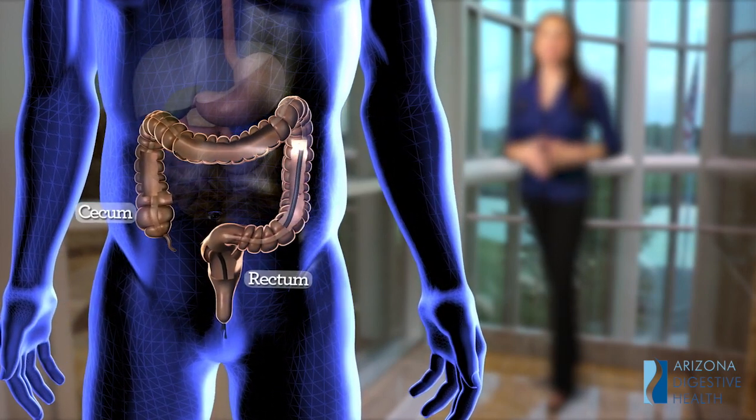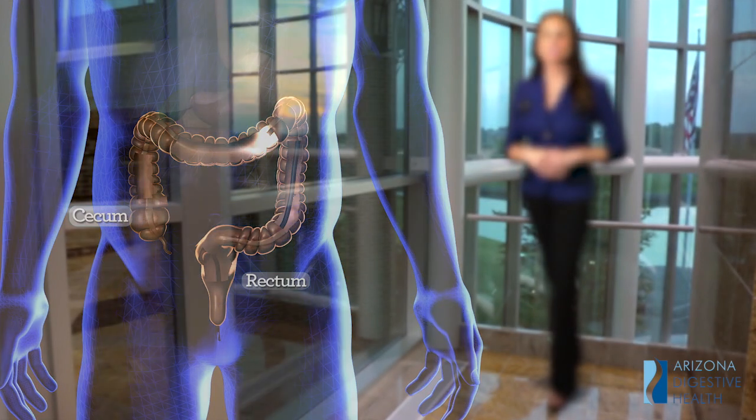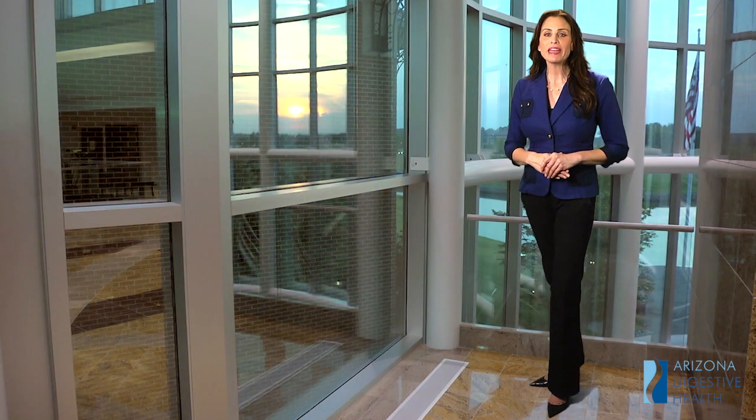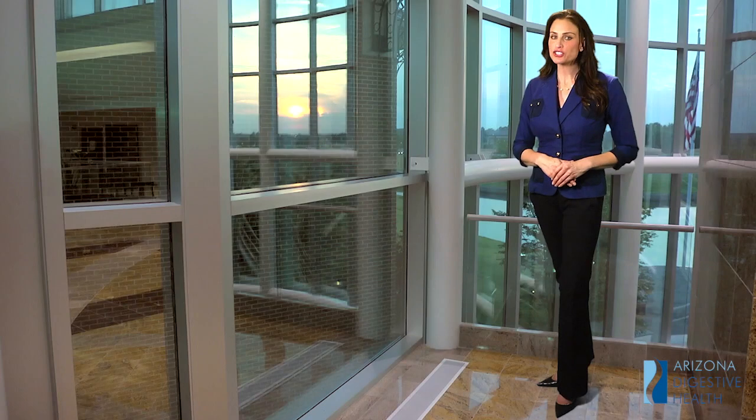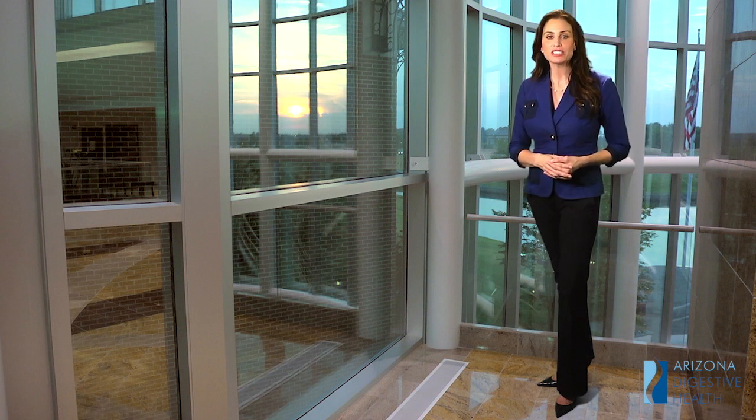With precise movements, your doctor will guide the scope into your rectum around the curves of your bowel to the lower left end of the colon, examining the lower GI tract's lining. The procedure may cause some discomfort. Although the sigmoidoscope is well lubricated, some discomfort may be experienced when it's inserted and navigated through the curves of your intestines. You may experience gas or cramping as air is used to inflate certain areas for a better view. Sigmoidoscopy is a short procedure and sedation or medications are normally unnecessary. Your doctor will further discuss with you if he believes medication is needed.